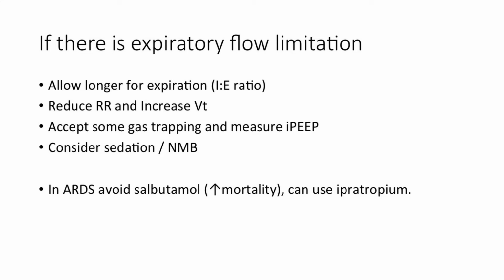Generally, if it's low and it's not causing hemodynamic upset, and they're not getting dynamic progressive breath stacking, you can just ignore it, but only if it's not too much. Often, for most problems on the ventilator, as you know better than I do, sedating and paralysing people is always very effective, but it's not necessarily the right thing to do in terms of progressing them away from where they started.